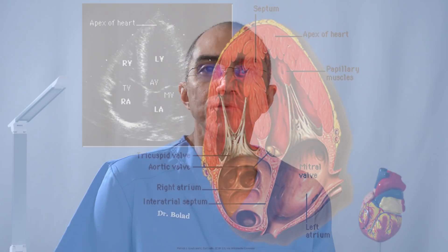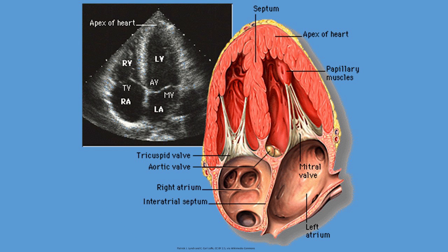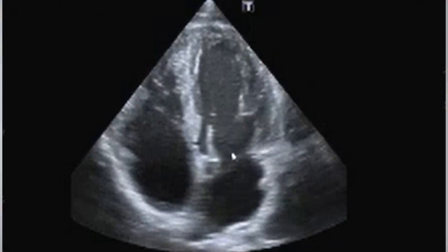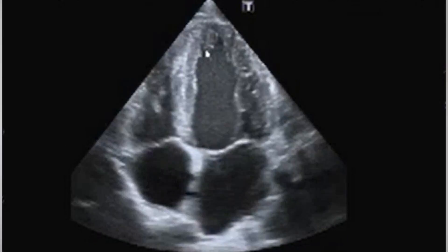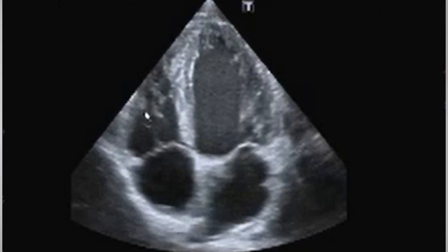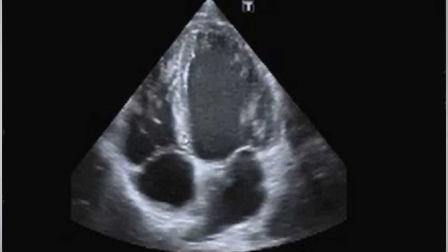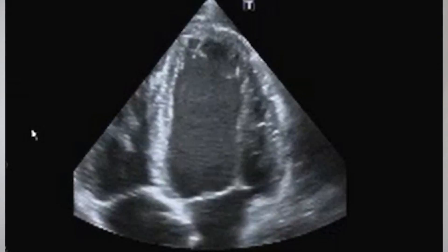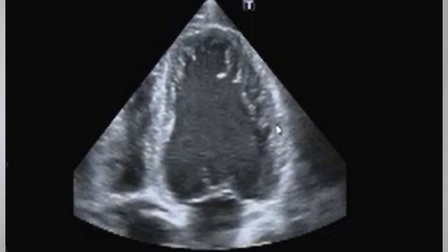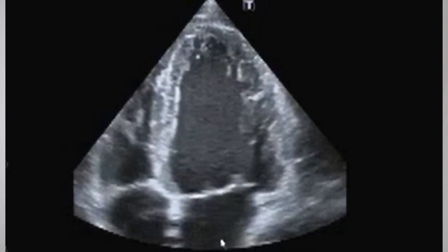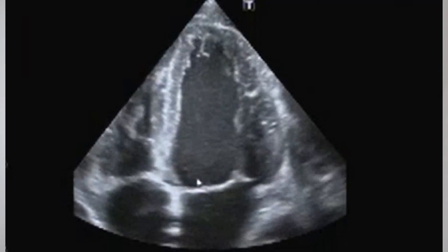I then move my transducer to the apex of the heart to get what we call the apical four-chamber view. This is how it looks, with the left side of the heart displayed on the right side of the screen and the right side of the heart displayed on the left side of the screen. You can see the left atrium, the mitral valve, the left ventricle, the right ventricle, and the right atrium. I then zoom into individual chambers to assess them and perform measurements, concentrating on the left ventricle and its walls, and clearly seeing the anterior and posterior leaflets of the mitral valve.